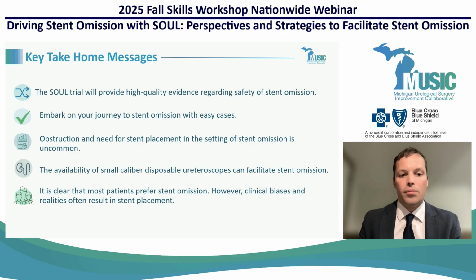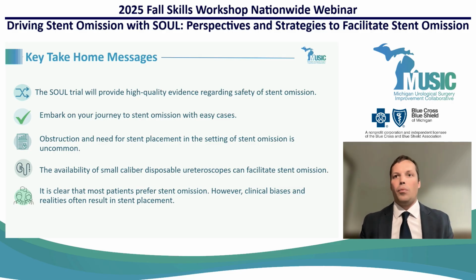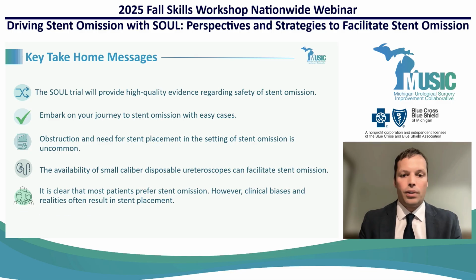It is pretty clear to me, and based on the results that Anne has conveyed today, that most patients prefer stent omission, not all, but most. But we do recognize that our own clinical biases as physicians and uncertainty do result in stent placement. And so these are things that we need to balance as clinicians, but also need to hear when patients come to us.